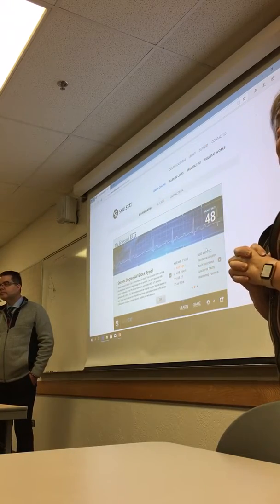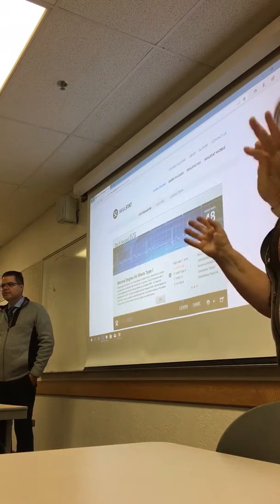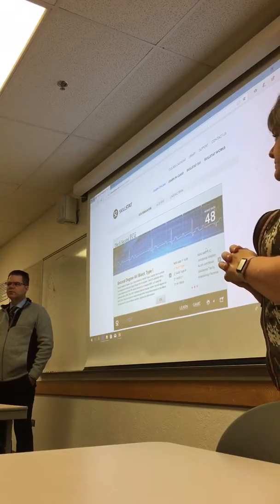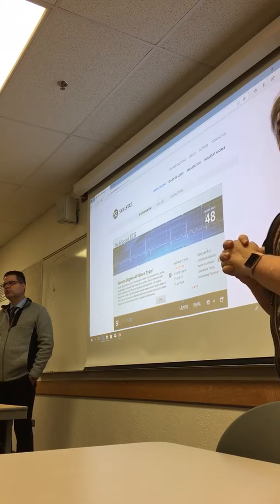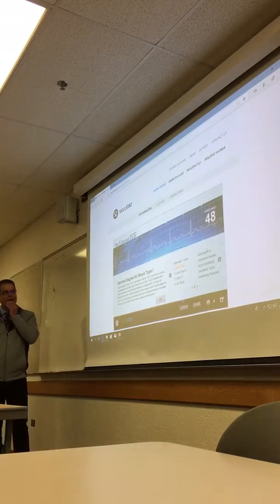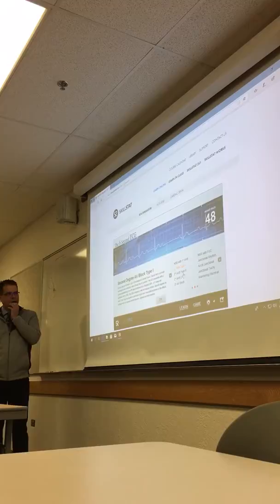And this will consistently have like 3 P waves that get longer until the missed one? Could be 5, could be 8, could be 2. But if it's 6 or 8, is it always 6 or 8 in that person's heart? Ooh, good question. I don't know the answer to that, sorry. I wish you'd look that up and teach me. I don't know if it's always the same. Okay, that's a second degree type 1. It can be called a Mobitz 1 or a Wenckebach.